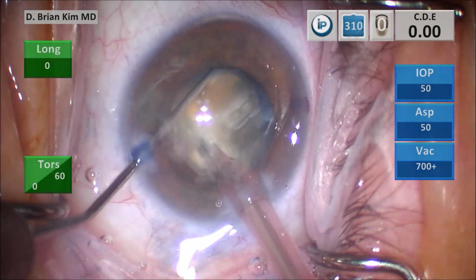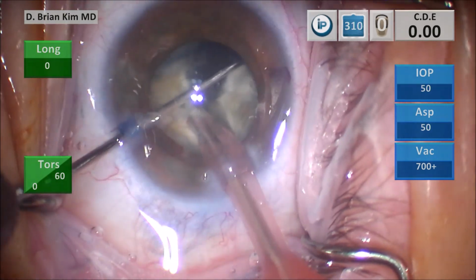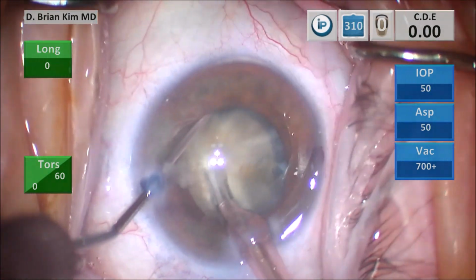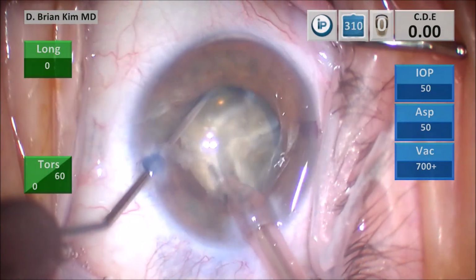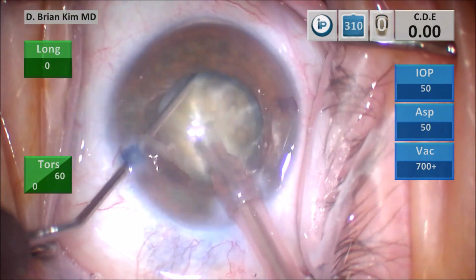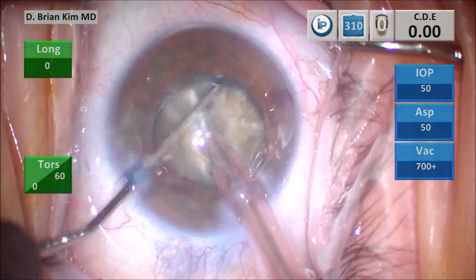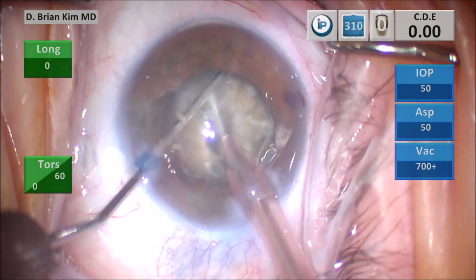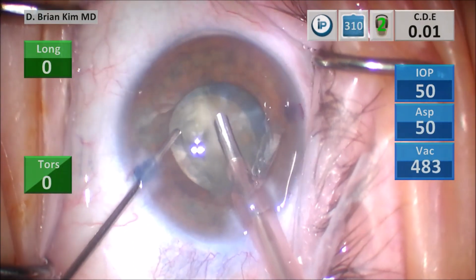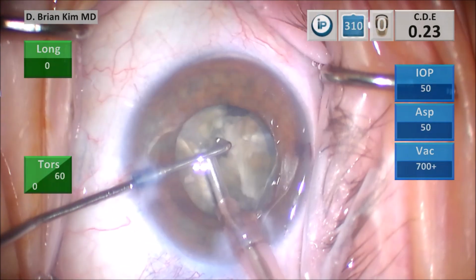I'm going after the first quadrant, which looks like the most free piece there, placing the chopper around the lens piece, pulling it towards the phaco tip, dividing that first quadrant in half, placing the chopper around one of the pieces there, using a little bit of vacuum as well as mechanical force to pull that lens piece up with the chopper, crushing it in half, separating it again using mechanical forces. Now I'm going to try to go after it with a little bit of vacuum, pulling one of the pieces up, emulsifying the piece.